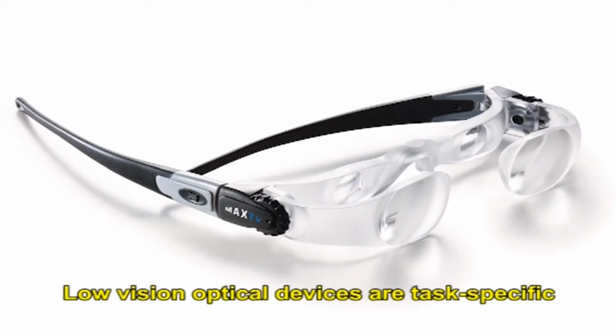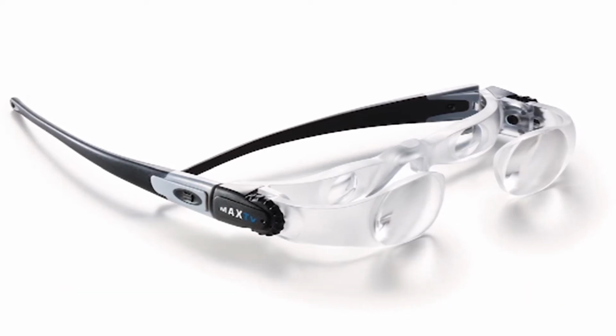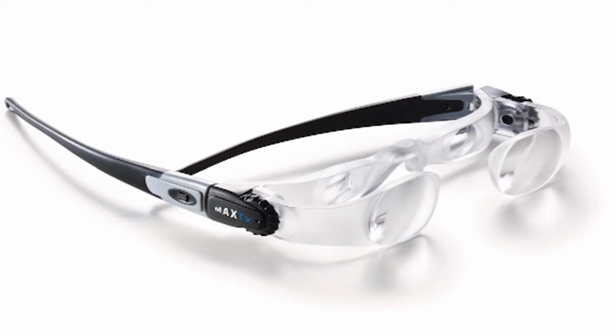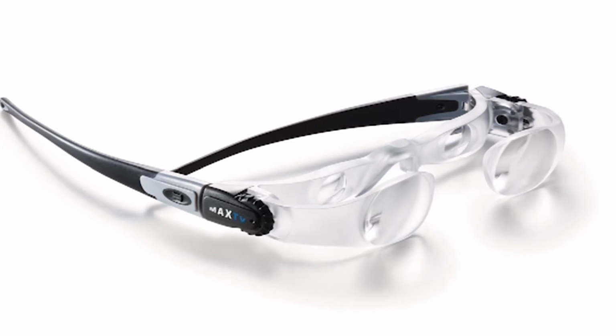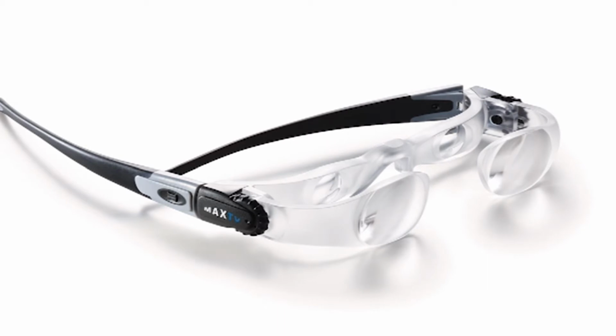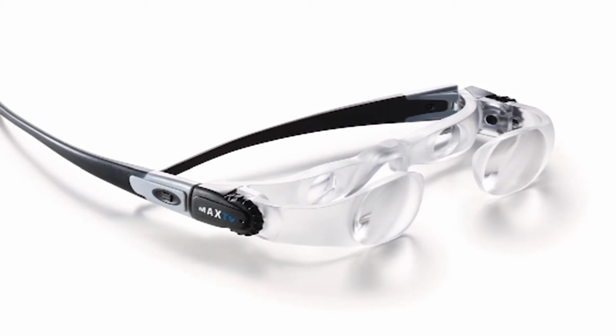Optical devices. Since low vision optical devices are task specific, there are different devices for different tasks. One device can be used for reading the newspaper, another for watching TV, another for spotting bus numbers or street signs, and still another for watching a football game or a play.